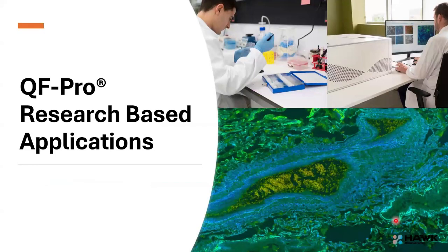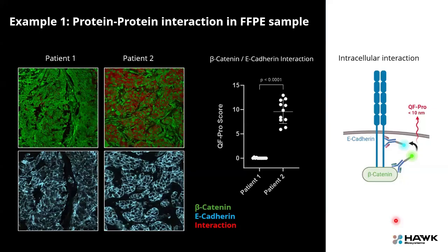And now I just want to briefly show you some other research-based applications that we have developed in the laboratory, so you have a little bit more of an idea of what can be looked at with this type of technology. In this first example, we look at the intracellular interaction between E-cadherin and beta-catenin. Therefore, we stain with their specific primary antibodies, then we use our secondary fragments, and we perform the QF-Pro assay. This was done in FFPE tissue of breast cancer patients.